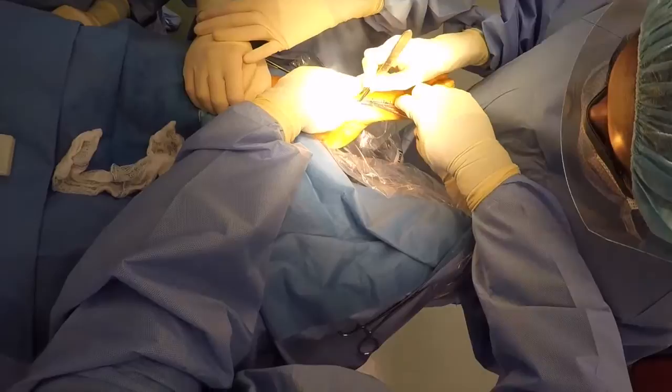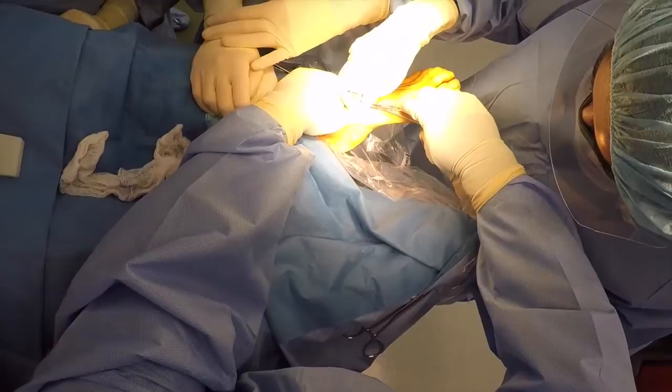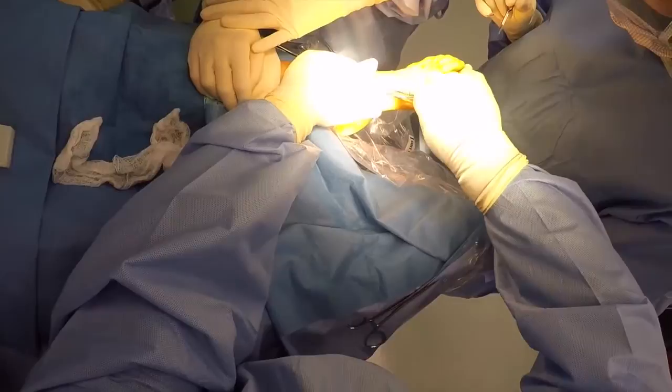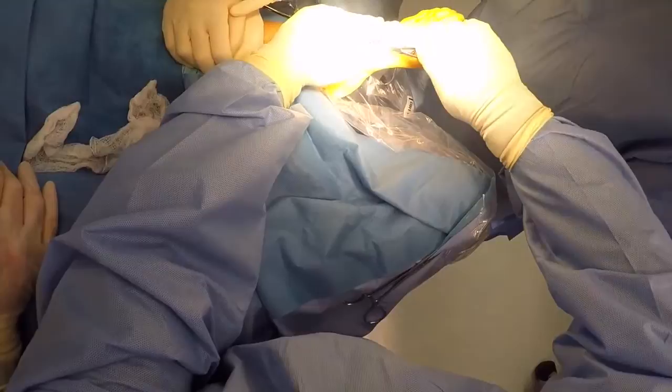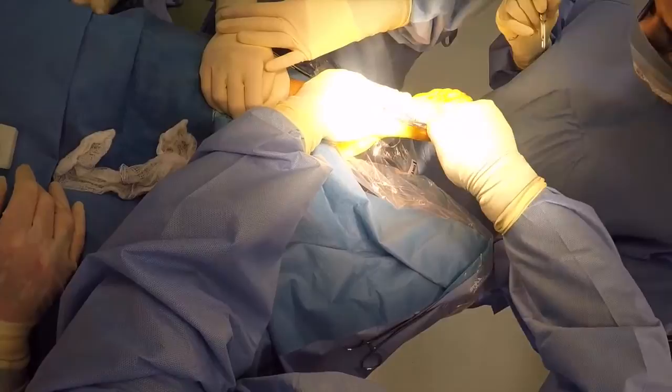We're dissecting. We have our incision over the medial foot. You want to sort of split the difference between the tibialis anterior tendon and the extensor hallucis longus tendon as it courses over the first metatarsal cuneiform joint. We use an extensive medial approach where we expose through one skin incision the entire surgical site, including the first metatarsophalangeal joint and proximal phalanx for our Akin osteotomy.